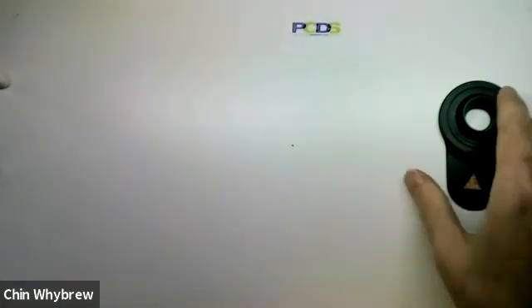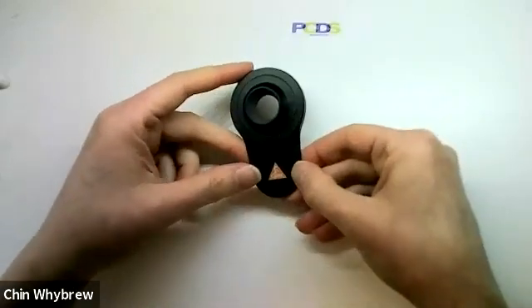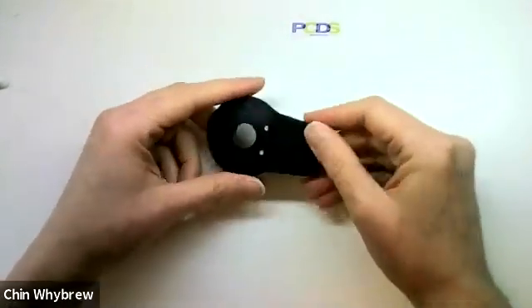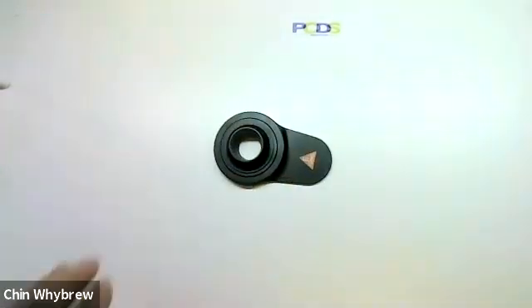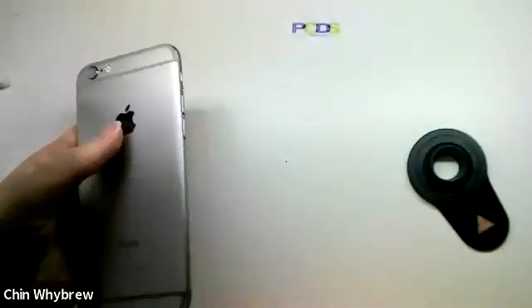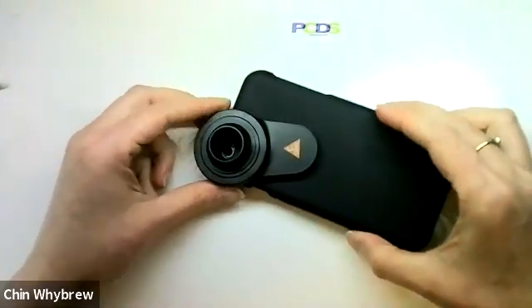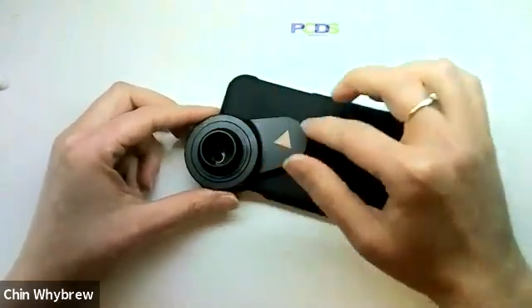Then we have this type of adapter. This type of adapter is a universal adapter, and this one happens to be a Heine one, but there are other brands available. They work on the principle that this piece here is adhesive — you take off the backing and it will then stick over the camera on your phone. You don't want to stick it directly to your phone, so what you're going to do is get the case for your phone and stick it onto the phone case.